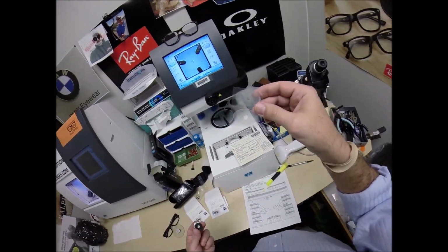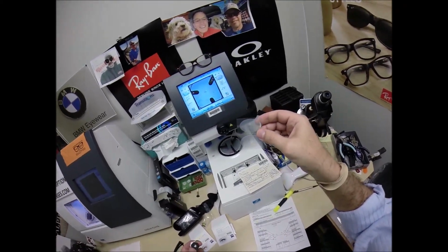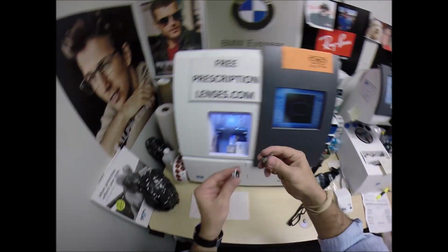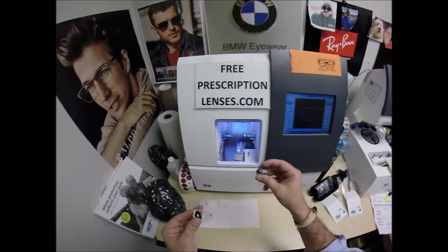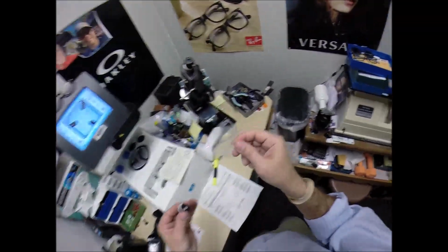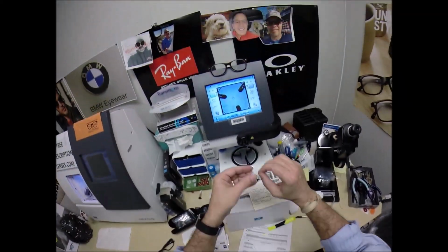Now, my early videos from before October of 2014, I had a Santinelli edger that I used to have to use these stickers on so it wouldn't slip in the chuck. A lot of times it's cutting the lens with these incredible hydrophobic surfaces, oleophobic anti-glare coatings would slip in the chuck. This equipment is designed for today's modern anti-glare lenses. I don't have to do that. Zeiss offers those for free.